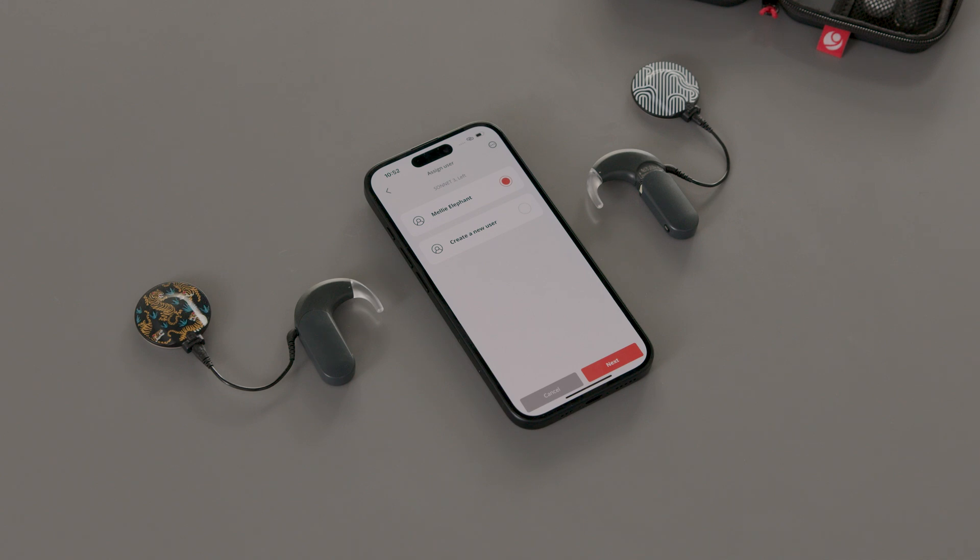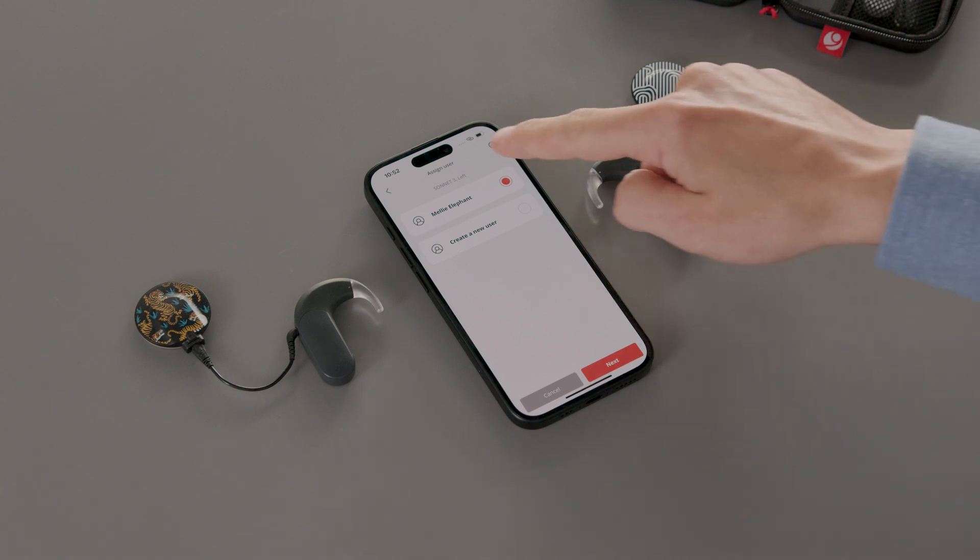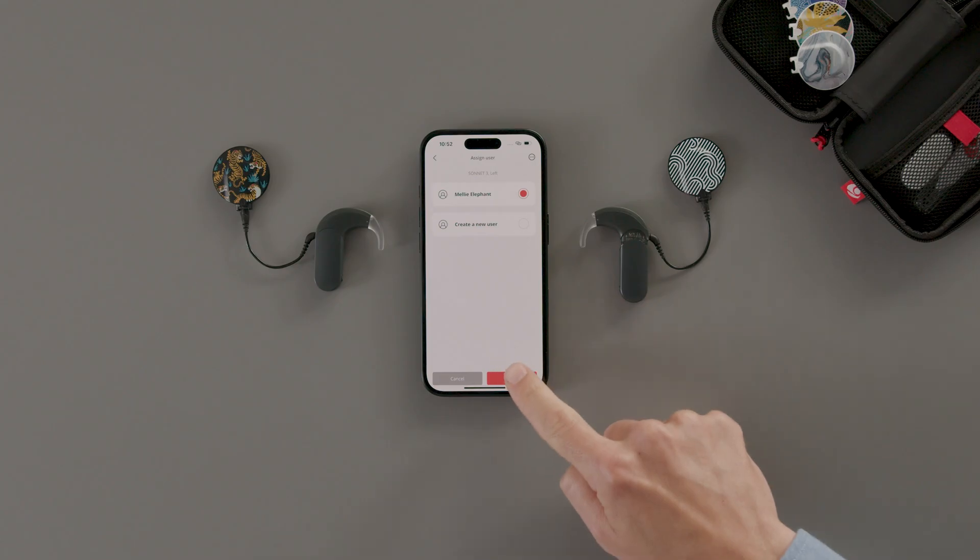Enter their name and tap Create. The audio processor is now paired with Audio Key 3. If it is your audio processor, select your own account and tap Next.